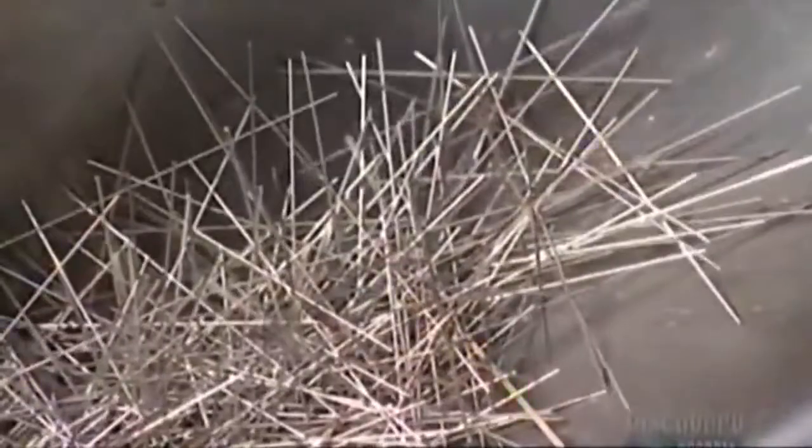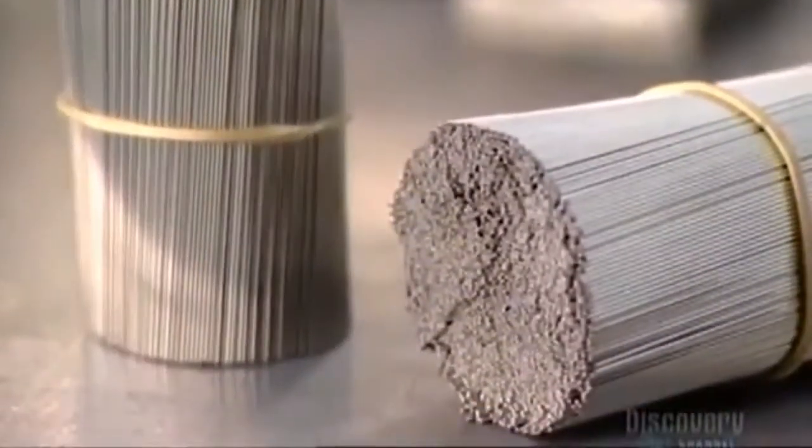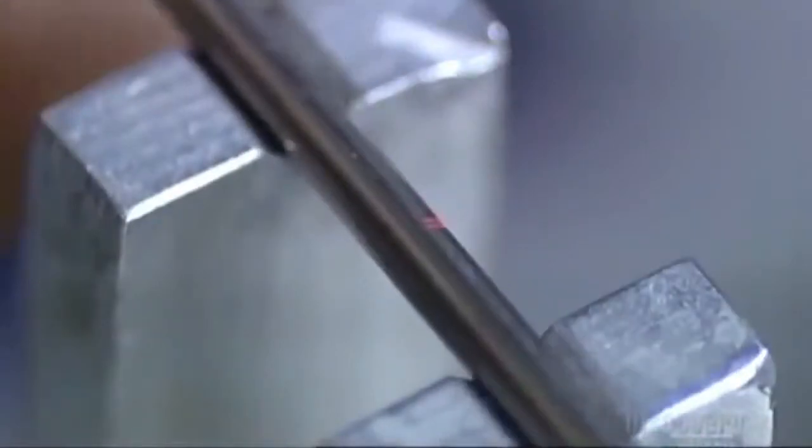The tubes fall into a bin in a tangled mess. The bin, driven by air pressure, agitates, and this shaking motion straightens them out. An operator bundles them together with a plastic band, but removes a few to check the specs.